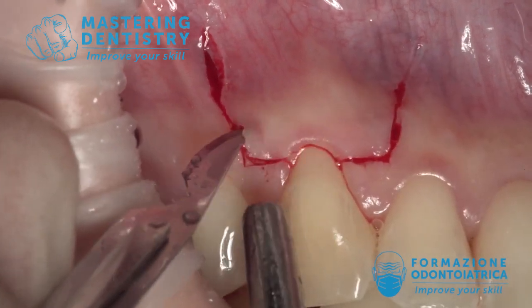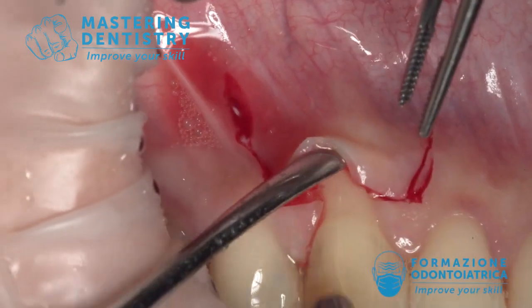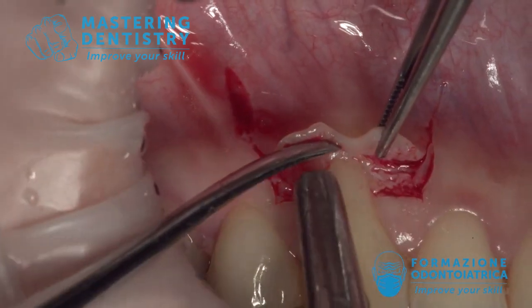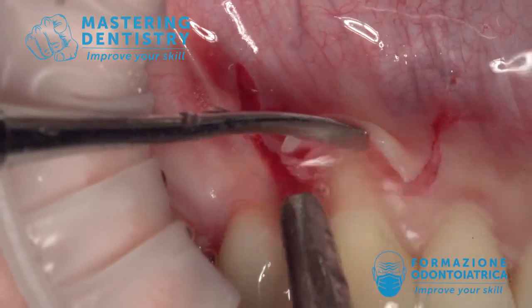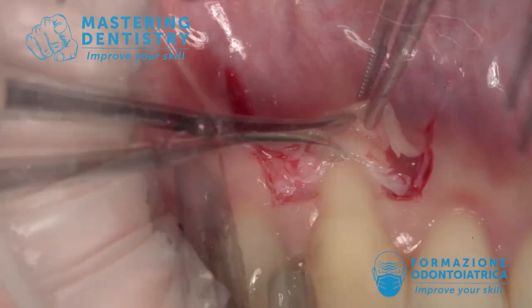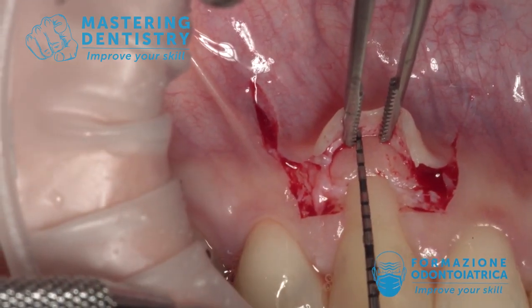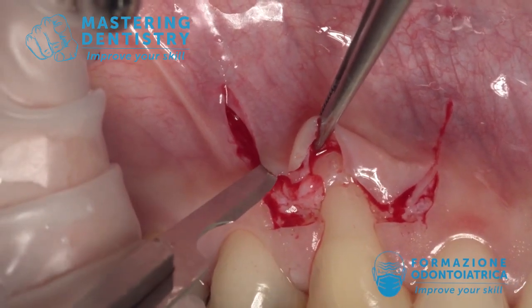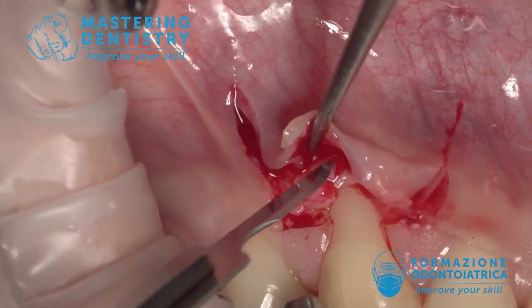Not the periosteum elevator. Now I must elevate a little bit of full thickness flap — so the surgical papilla are split thickness, while this part is full thickness. I have found the bone crest and then I expose the bone for three millimeters.